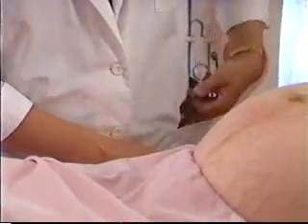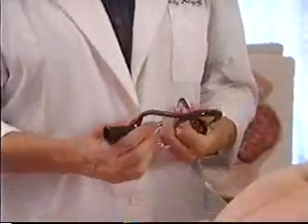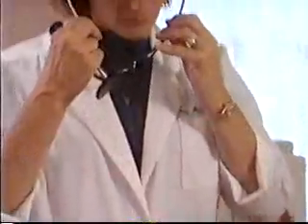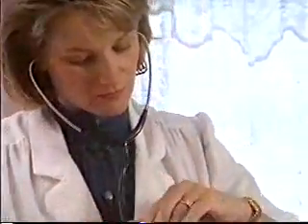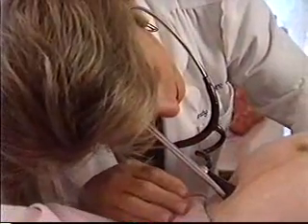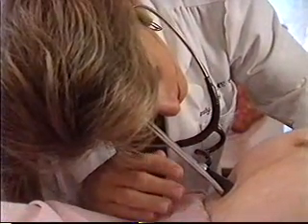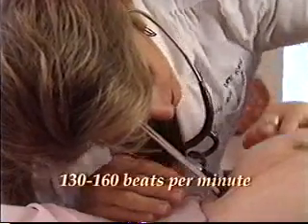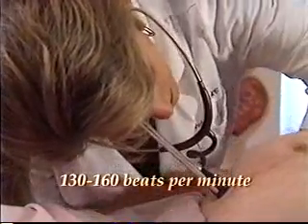The mother's heart rate by Doppler or fetoscope will be much slower and make a swishing sound. If you are unsure whether you are hearing the fetus or the mother, check the mother's radial pulse as you listen to the heart rate. Once you identify the fetal heart tones, take a moment to assess the rate and strength of them. Fetal heart tones are rapid and deep, usually around 130 to 160 beats per minute.